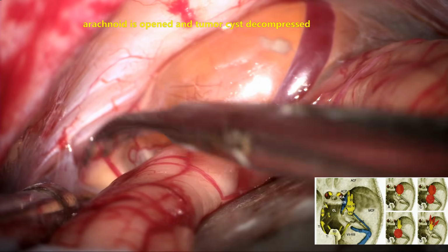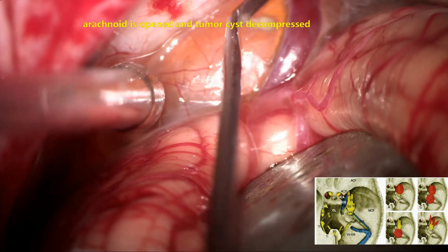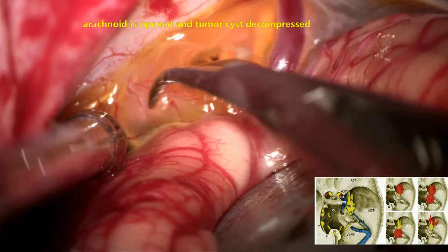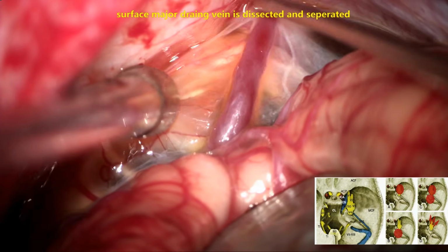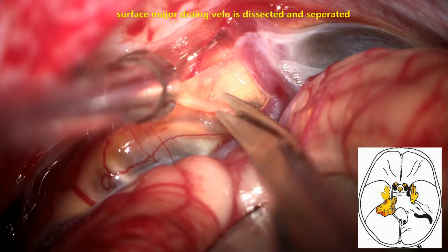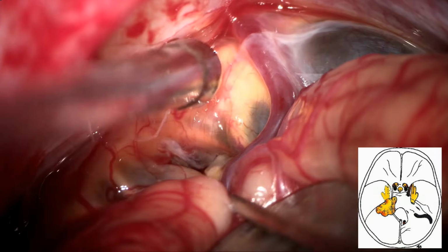The most important step here: usually these lesions are intra-arachnoid. The arachnoid of the lateral cerebellobrainstem space is opened widely. This is very important to have a smooth, comfortable, and safe excision. Once the arachnoid is open, the tumor cyst wall or capsule is opened and the tumor cyst is let out. Again, that helps in reduction of the pressure or mass effect on the cerebellum, and the cerebellum becomes lax.